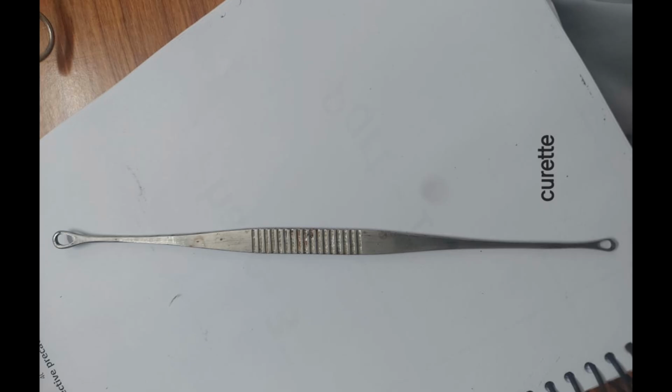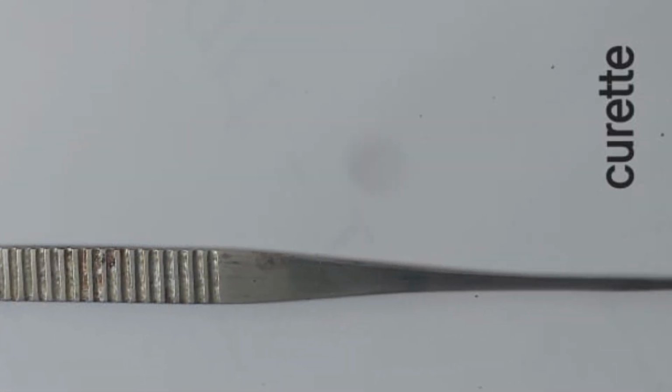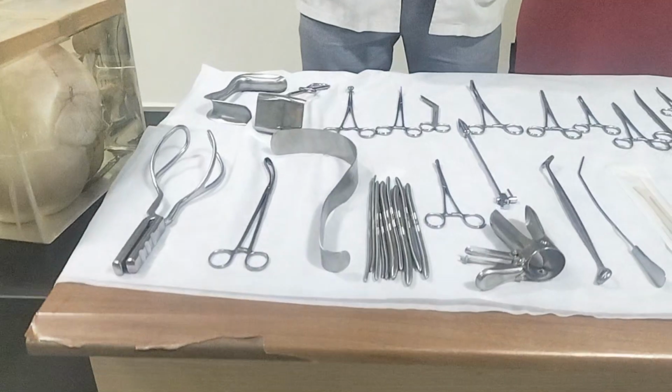Okay, this is the uterine curette. Okay, one is a sharp end, another is a blunt end. Okay, it is used during D&C, that is dilatation and curettage. Okay, excess dilatation and curettage can cause Asherman syndrome. That's it.